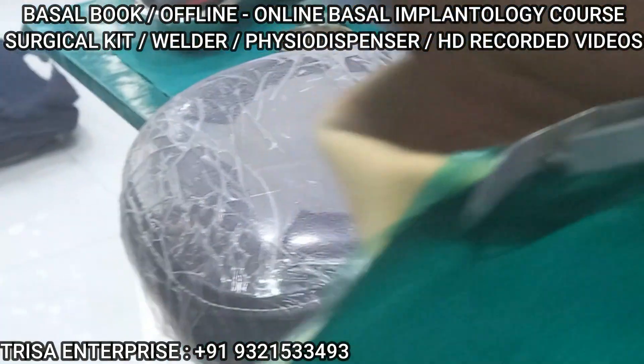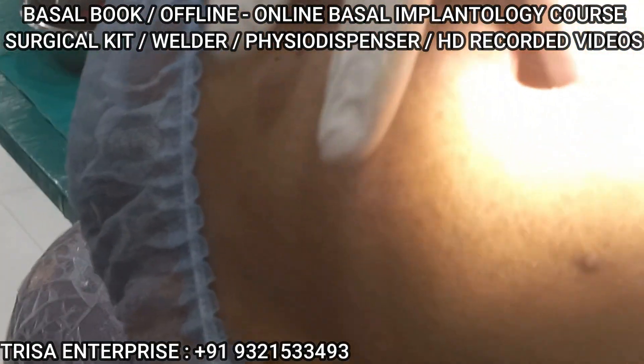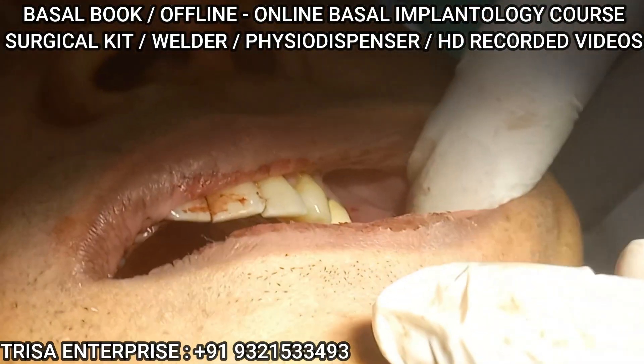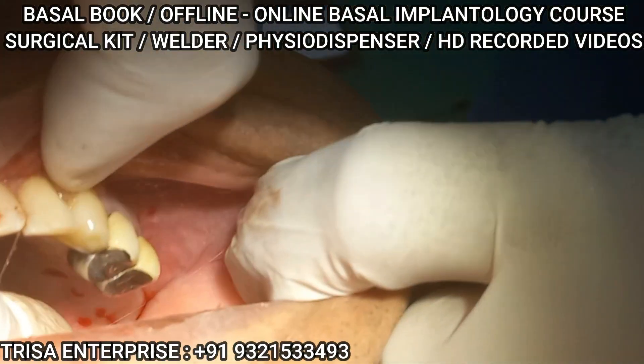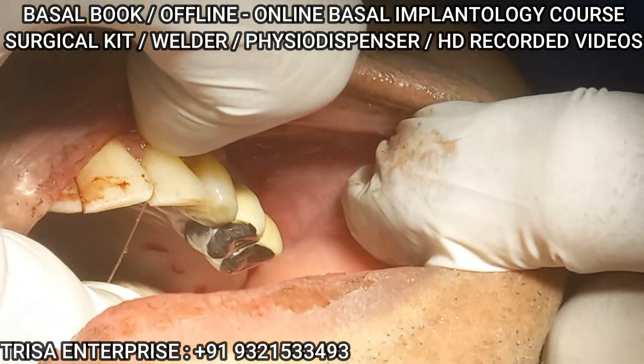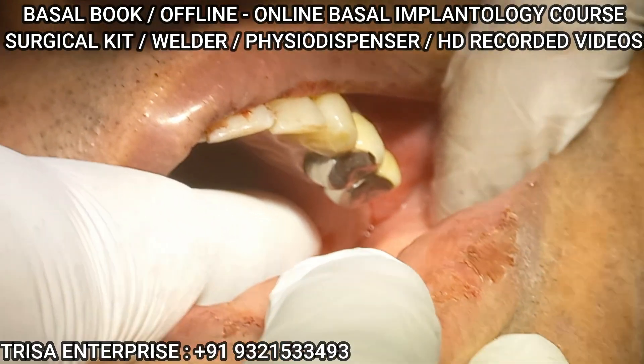It's a half-hour work on the left side. Not tired or anything. What we do is — suction, please. First, we have to palpate. You can palpate here. See this — just palpate. And you can palpate the tuberosity.